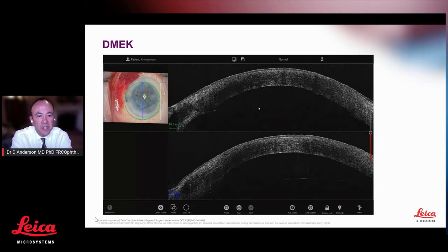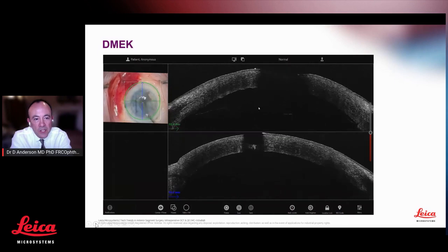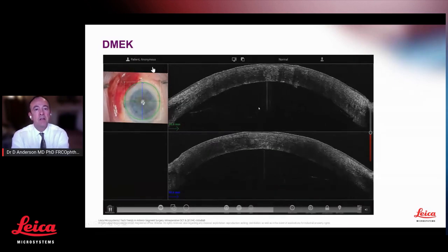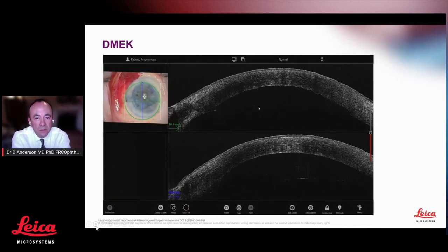Thank you. Next slide, please, Shio. Oh, there we are. Yeah, we can see the DMEK being tapped out there. And then you'll start to see it appear. Perfect. Thank you.